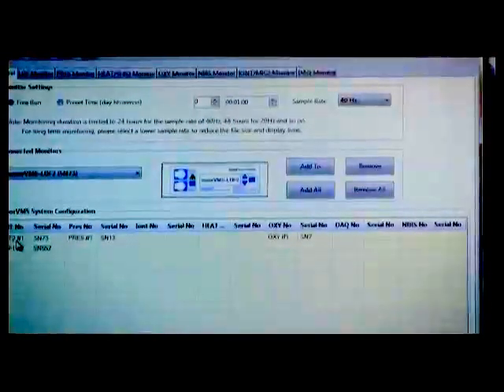This includes a standard power laser Doppler system, a high power laser Doppler system, a pressure cuff control unit, and a tissue oxygenation system. The window demonstrates that all devices are attached effectively, so we'll click OK and move on to the display setup.